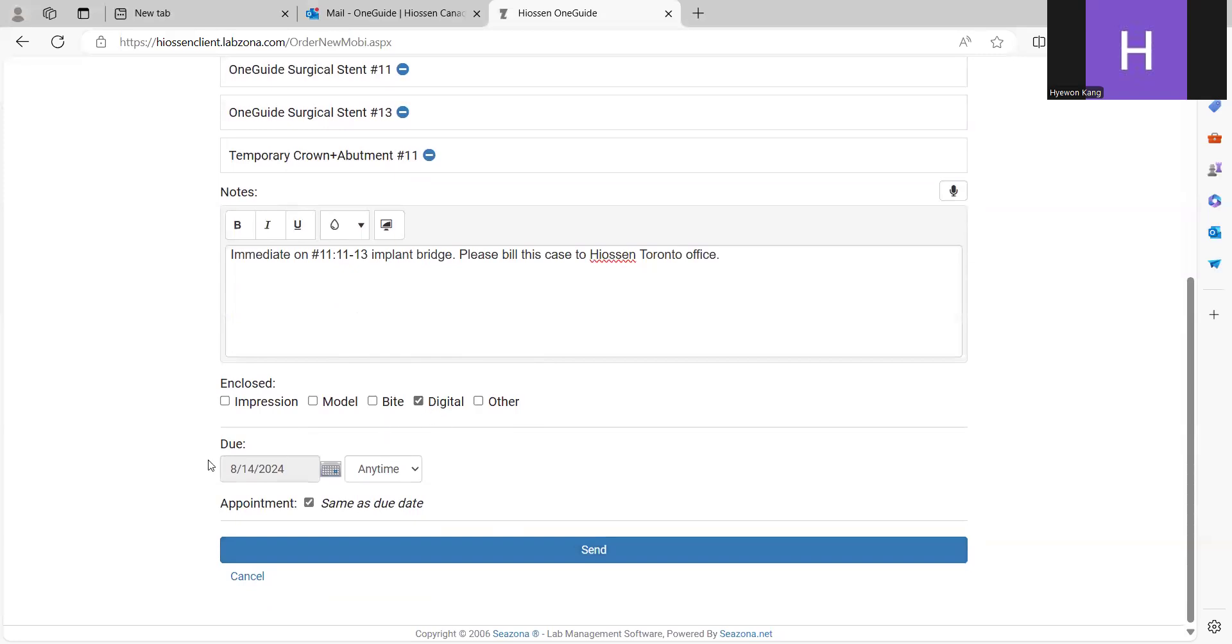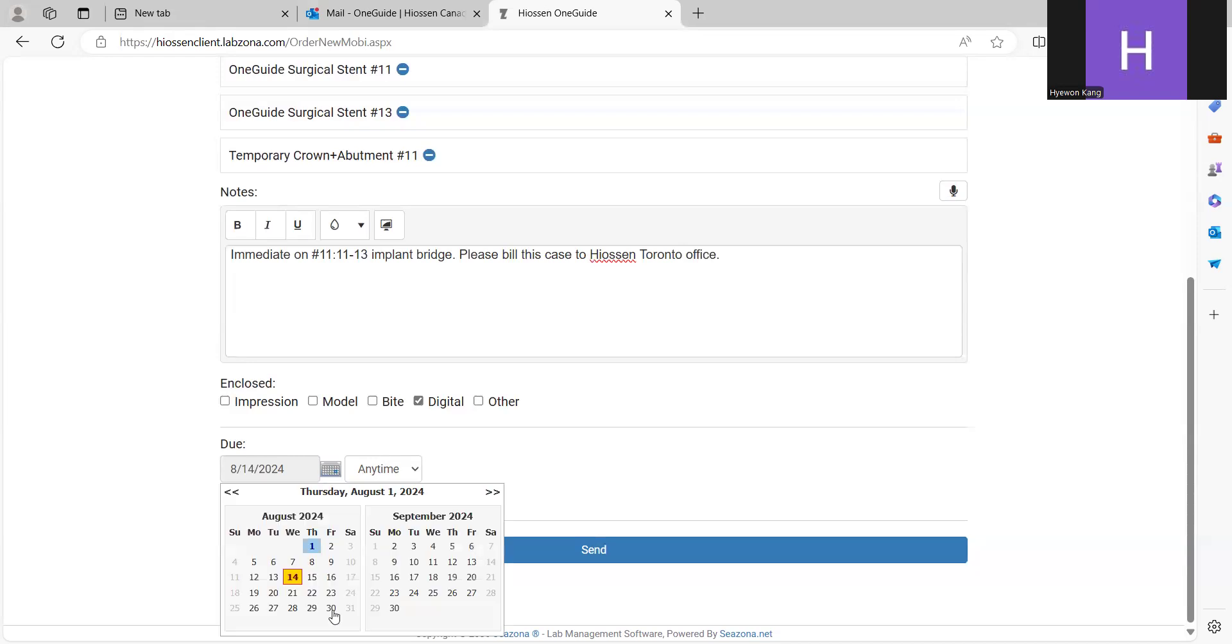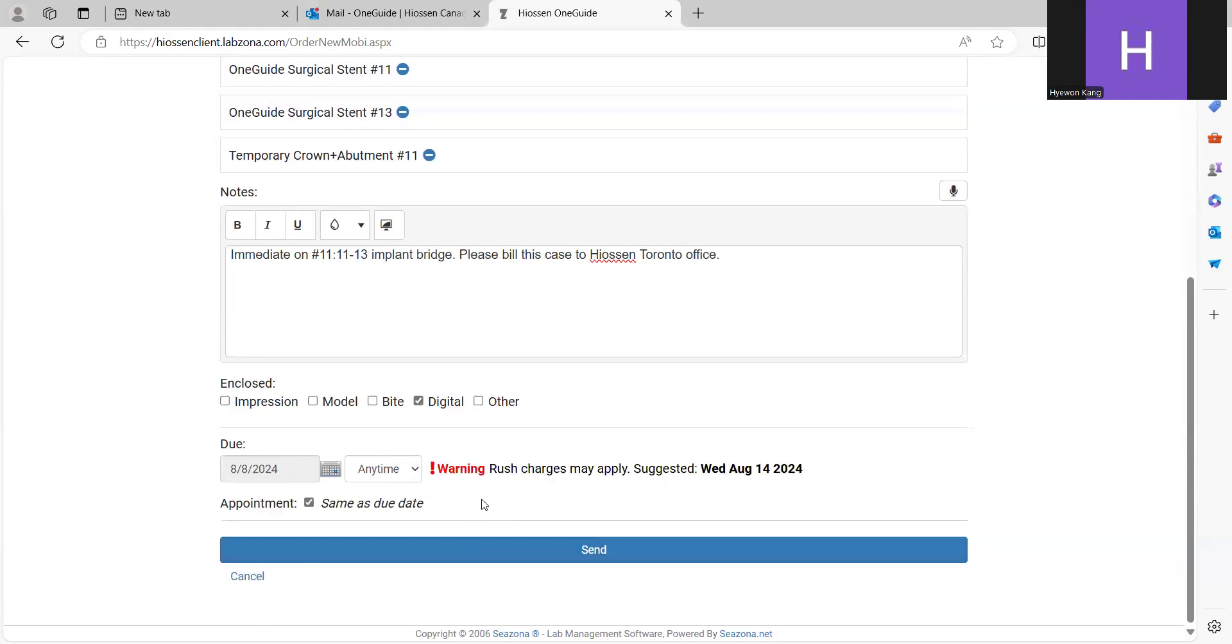Due dates refer to the regular production duration. Our standard duration is 10 business days. If you set the due date before the regular time, a warning will appear for the express planning fee. Let's say I set it before the 10 business day. As you can see, the warning message shows up.